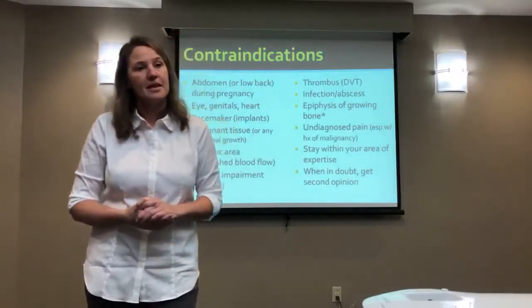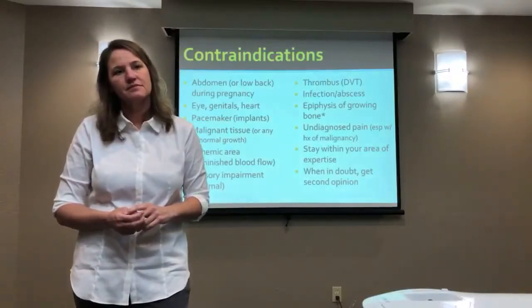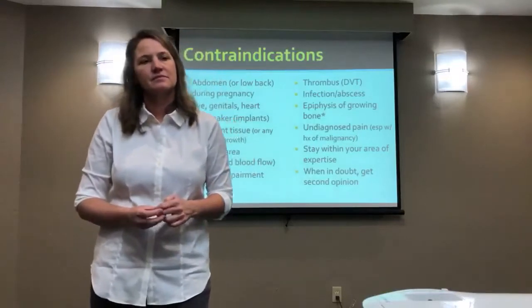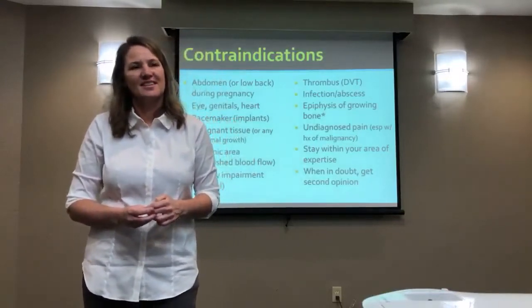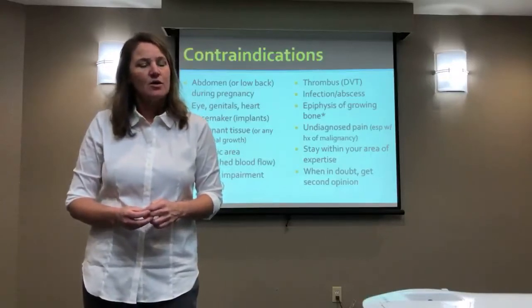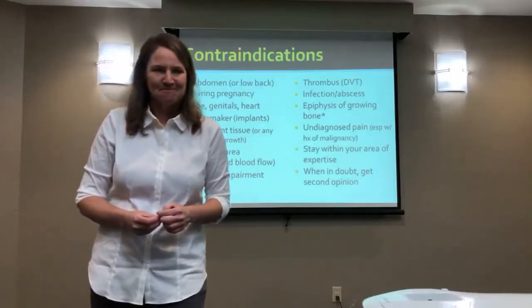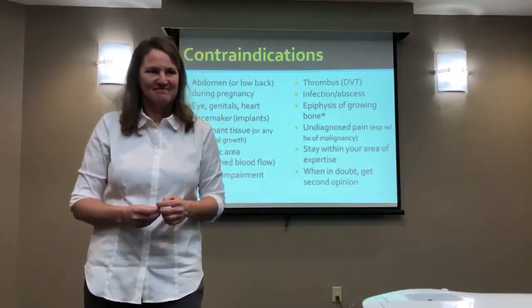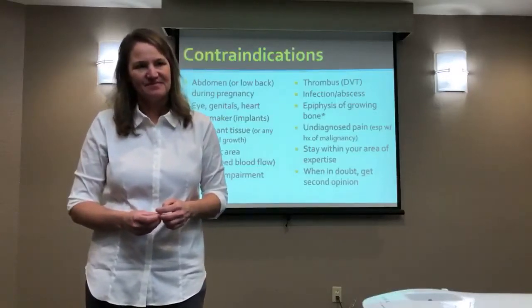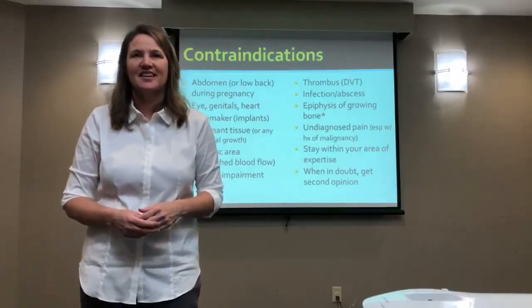And the reason we did this is because we have one particular doctor that sends a patient, no exercise, ultrasound, all zones, whatever that means, shoulder. And we're like, all zones? Ultrasound, all zones, shoulder. So we keep sending them the lack of science behind this. And we refuse not to do exercise or joint mobs or really treat. That's interesting. I've never heard that before.